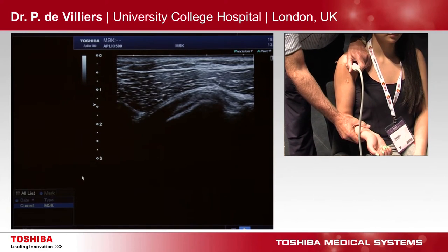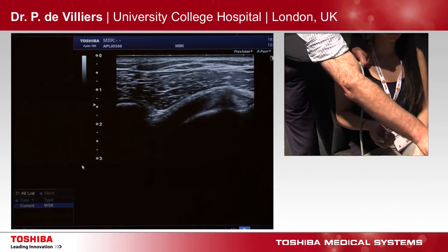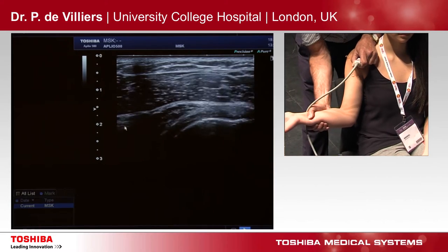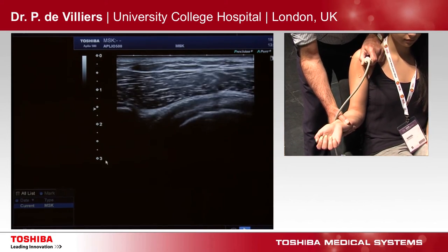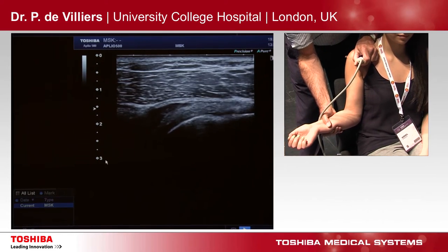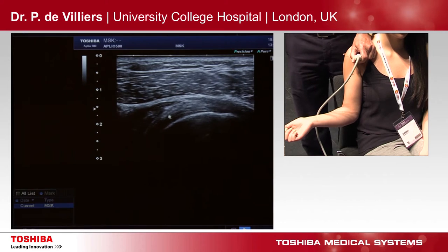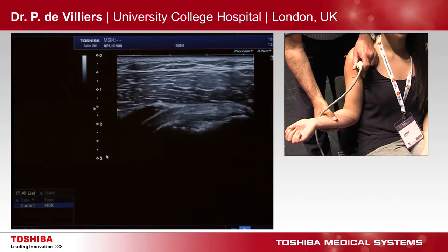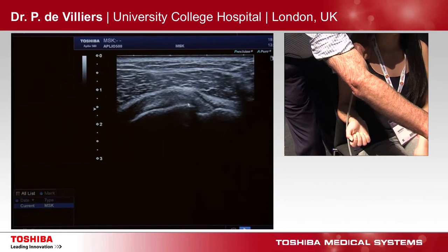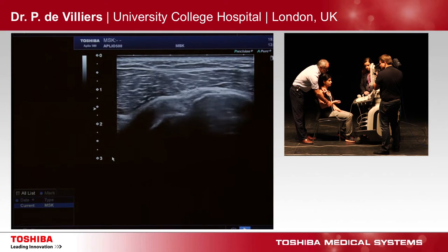Next we see in the medial aspect the subscapularis. We're going to assess it dynamically. Get your coracoid on the left-hand side — you can see your coracoid sitting there. And then we're going to pull the subscapularis out. Women can go quite far, to about here; men can only go to about there — that's why women can walk through a door with their hands by their sides and men can't. So you can pull it out until you can probably see the muscle-tendon junction. Pay attention to the bottom part and to the top part; the top part is normally where the pathology will happen. The tendon moves smoothly.